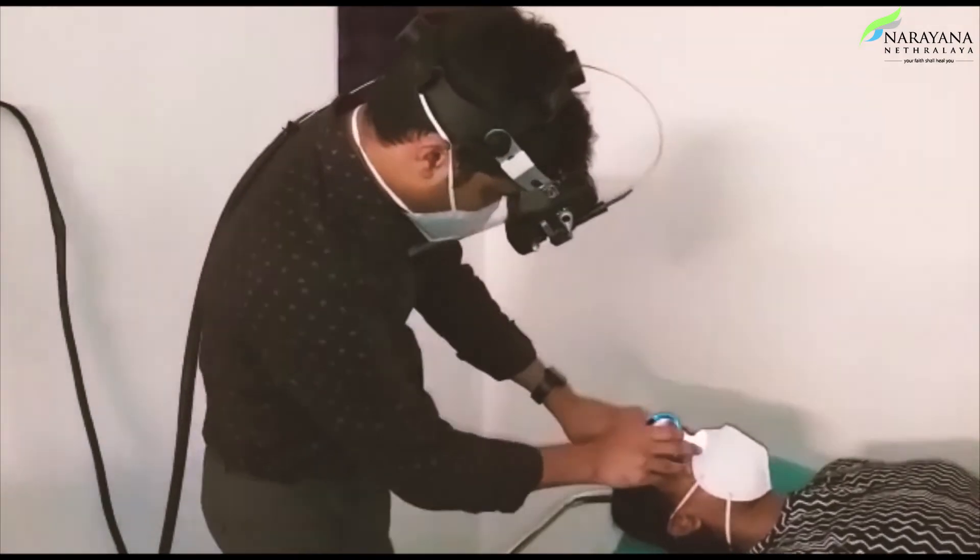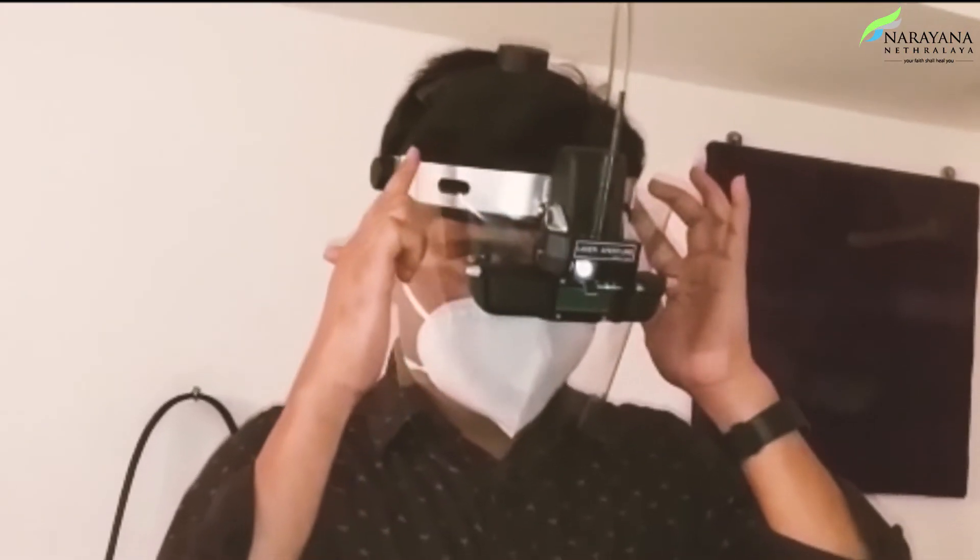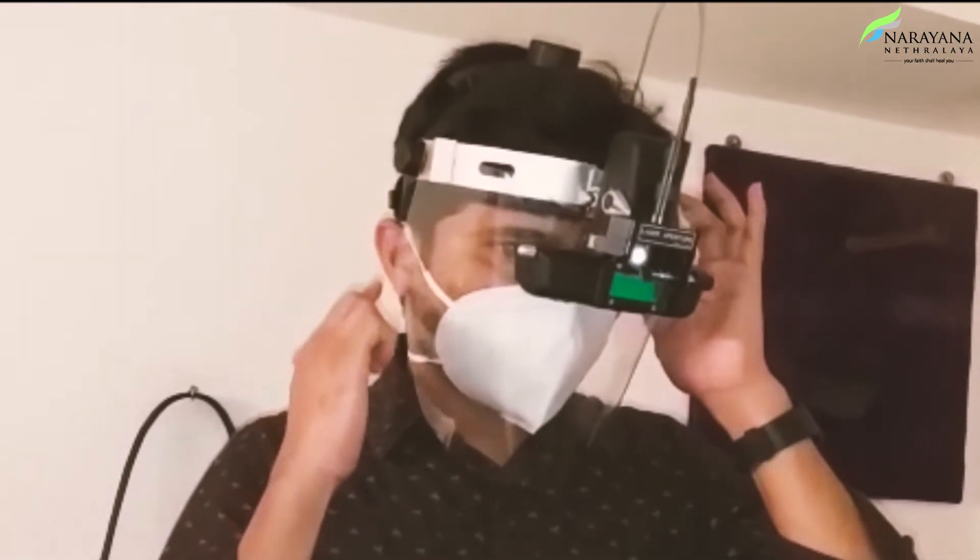This can also be used for retinal laser examinations. The curved design ensures stability and avoids unwanted reflections.